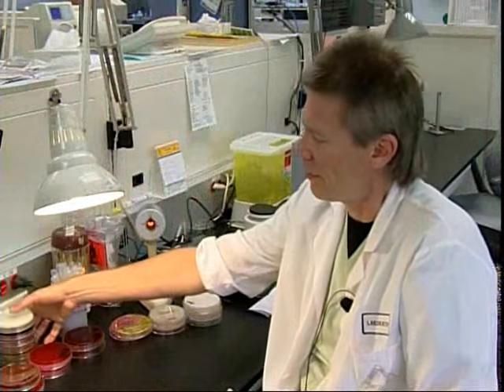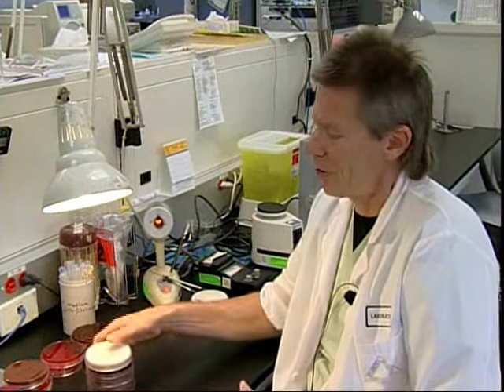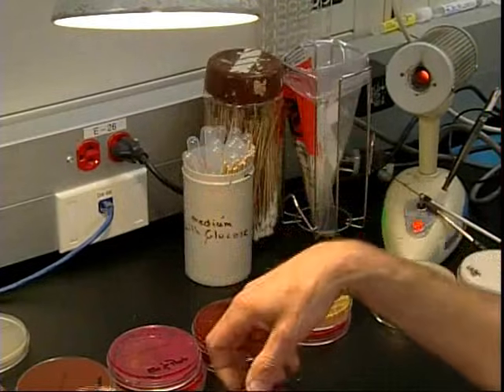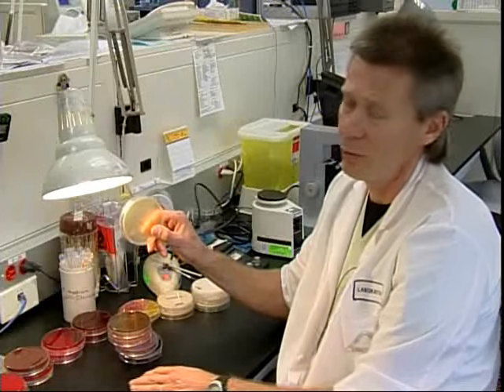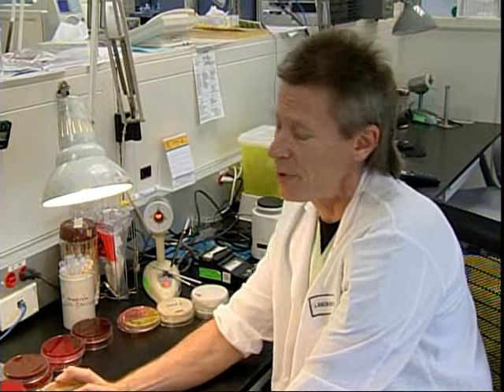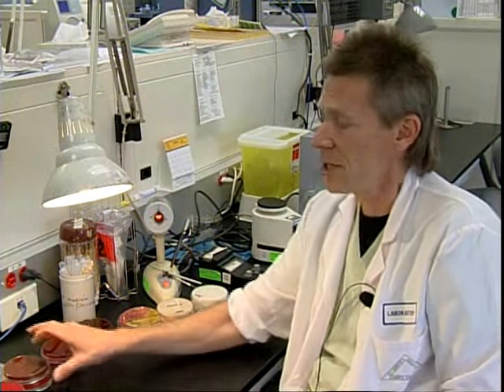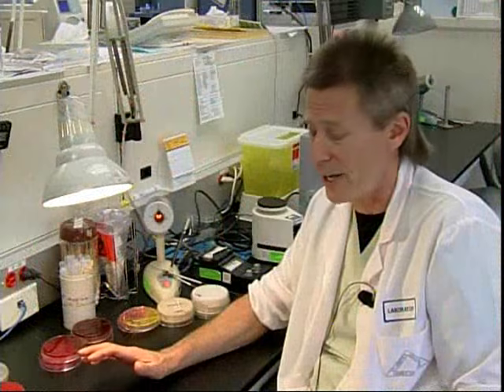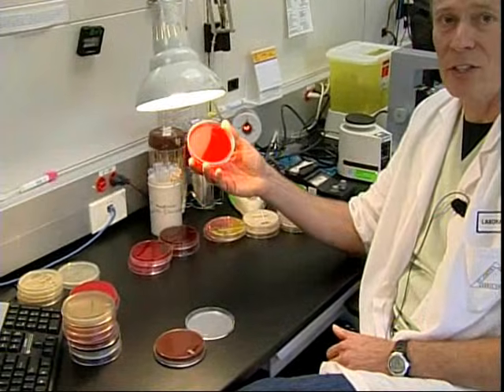We have a whole variety of agar plates. They come in all kinds of colors: white, black, pink, orange, green, yellow, and they all serve a different purpose. What we set swabs or specimens on depends on the site that the specimen is taken from. For instance, an eye swab will just get a chocolate plate and a blood agar plate. The reason is that everything we're looking for in an eye swab that can cause infection can be isolated on these two plates.